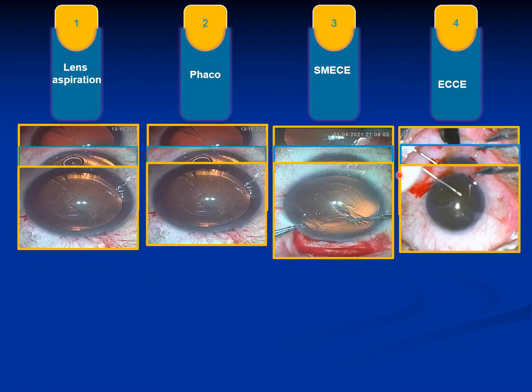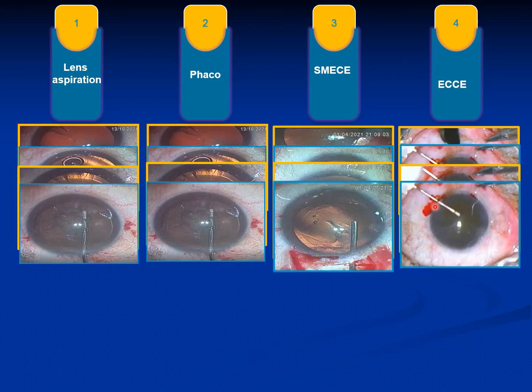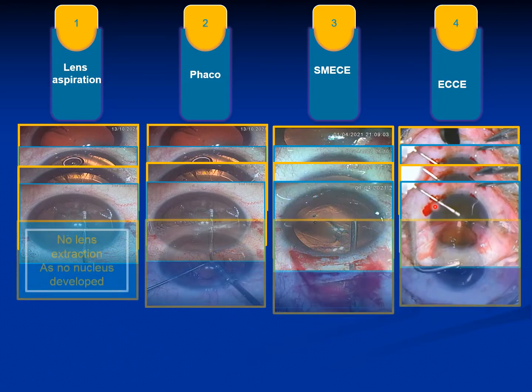And then is the capsulotomy. You can see the roundish capsulotomy, or cutting of the anterior capsule, which is called CCC, continuous curvilinear capsulorhexis. It is the same in this one, while this one is a can opener capsulotomy, which is like small cuts made over 360 degrees. Then is the hydrodissection, the same for all of them.